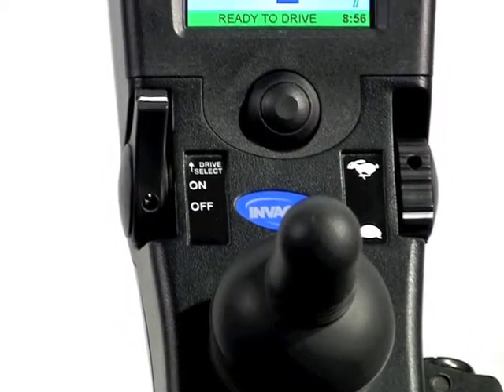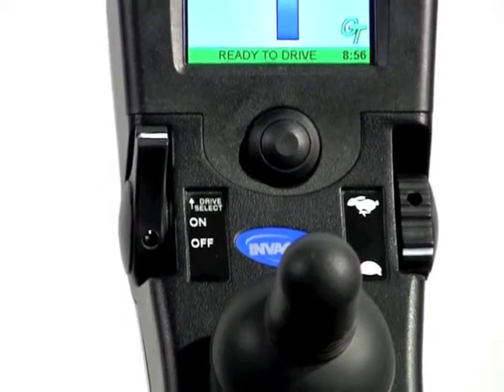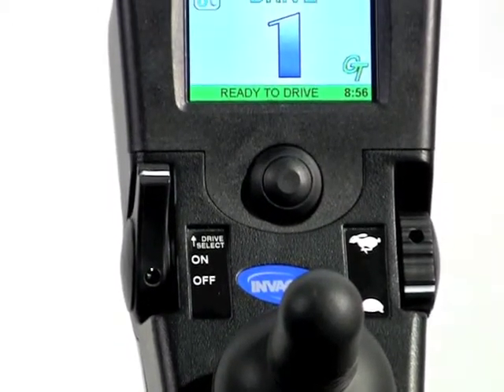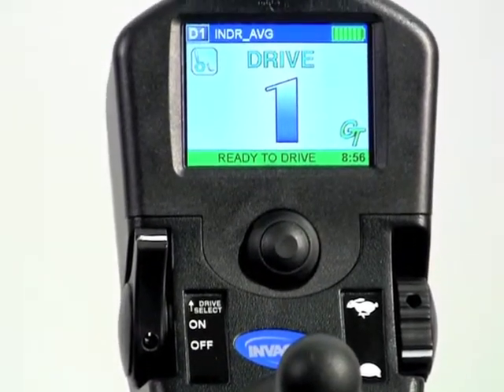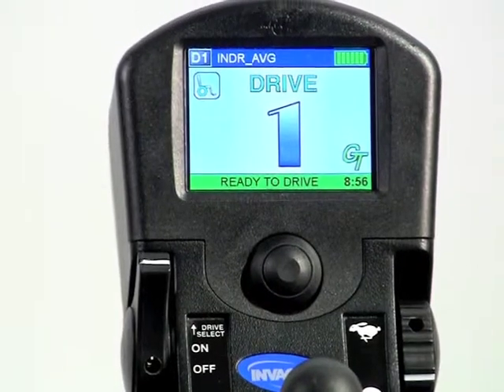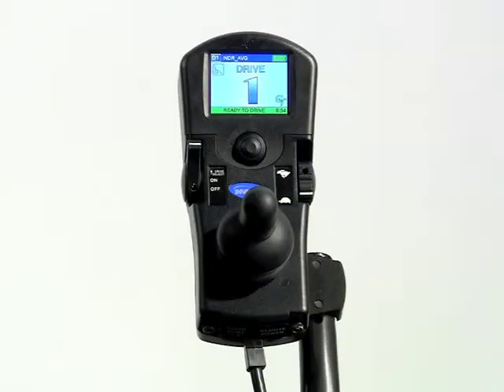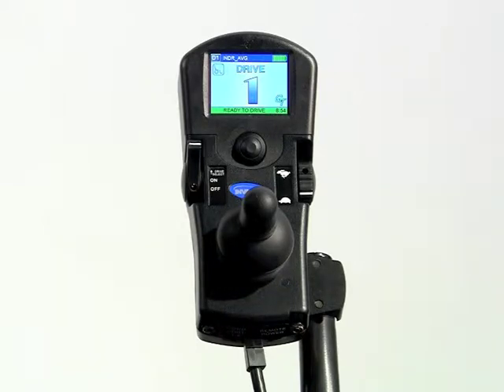As an RTS, clinician, or technician, you have the ability to dedicate any drive profile to operate only one mode other than driving. This allows quick and easy access to that mode for the user. For this example, we will dedicate drive four to only operating powered seating and not driving.